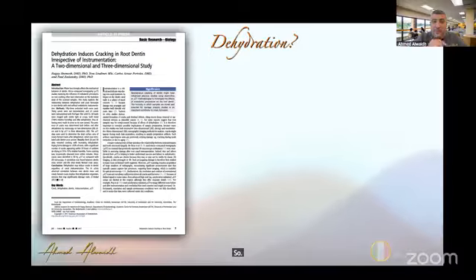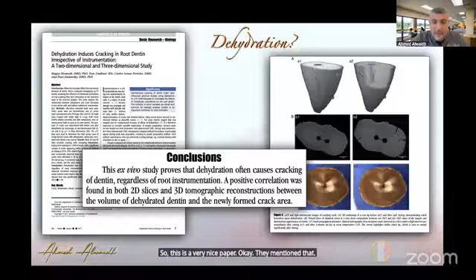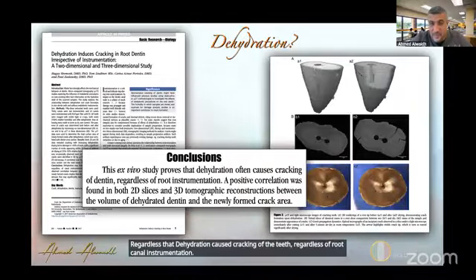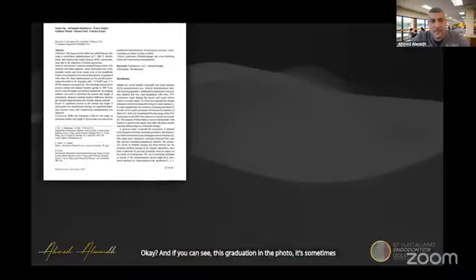So this is a very nice paper. They mentioned that dehydration causes cracking of the teeth regardless of root canal instrumentation. And if you can see this crack generation in the photo, it's sometimes within seconds.